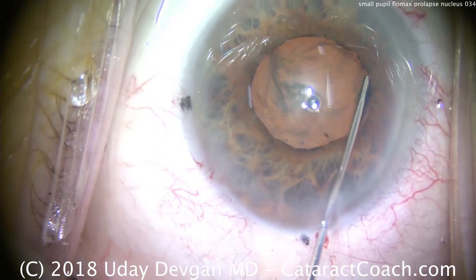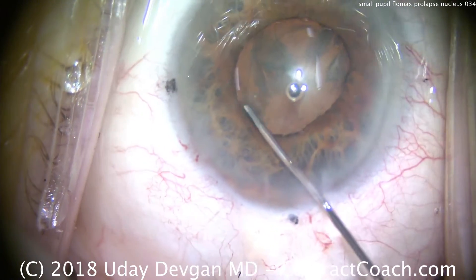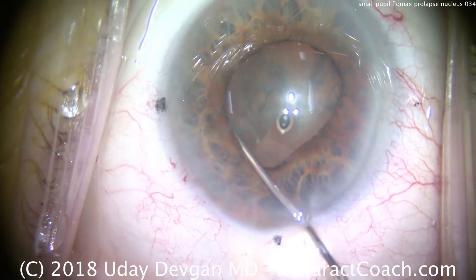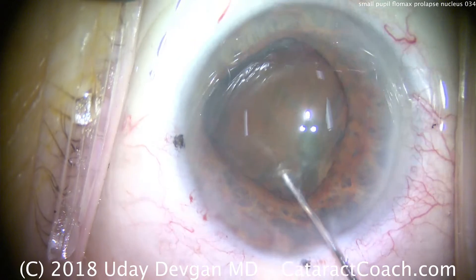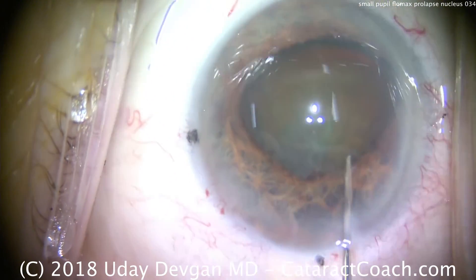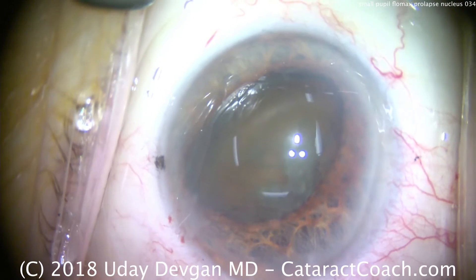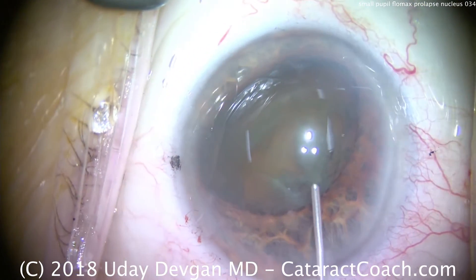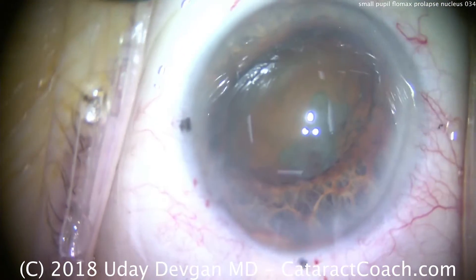Now that the rexis is complete, I'm sure I have at least a 5 millimeter rexis. We can now prolapse this nucleus out of the capsular bag. Gentle on the hydrodissection — this is not forceful. I don't want the iris to prolapse out. That's just about sufficient. Now dig in and bring that nucleus up, and there we have it. It's a relatively shallow anterior chamber — this is a 25-diopter lens — so we can only bring it partially out. We re-coat the endothelium using dispersive viscoelastic.